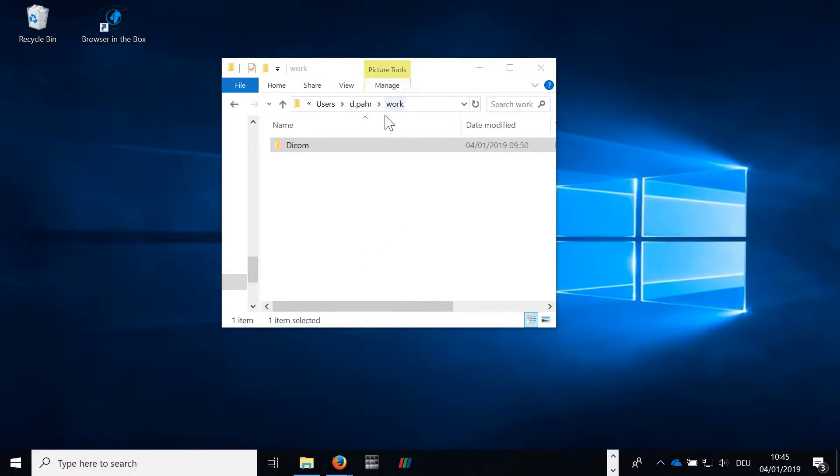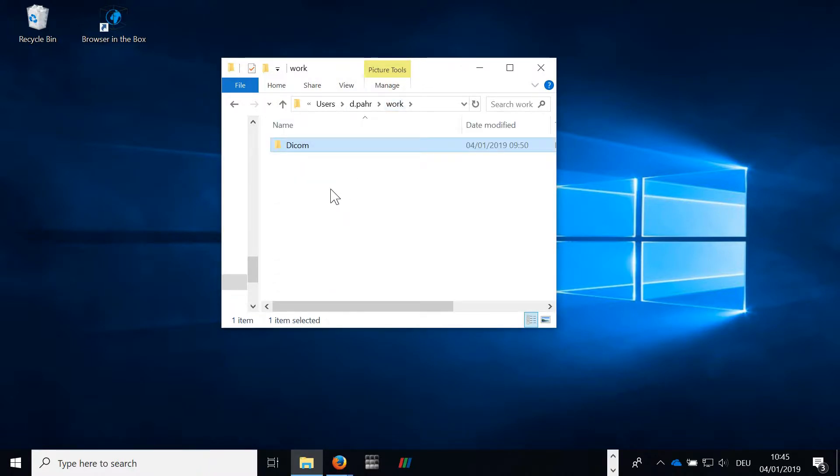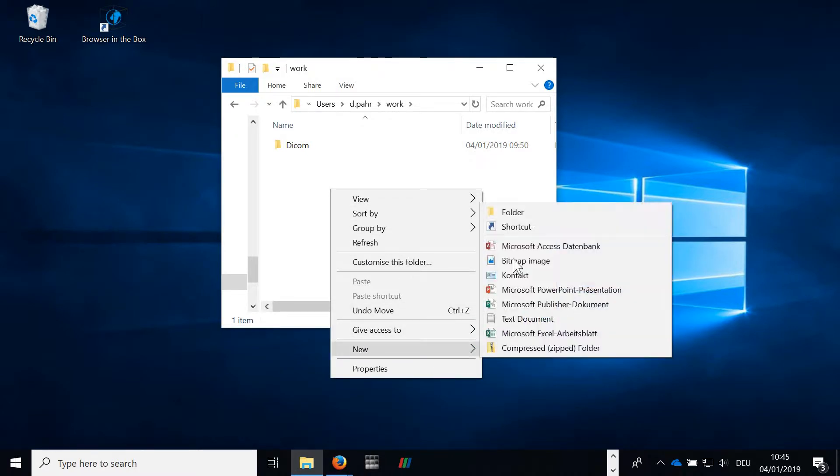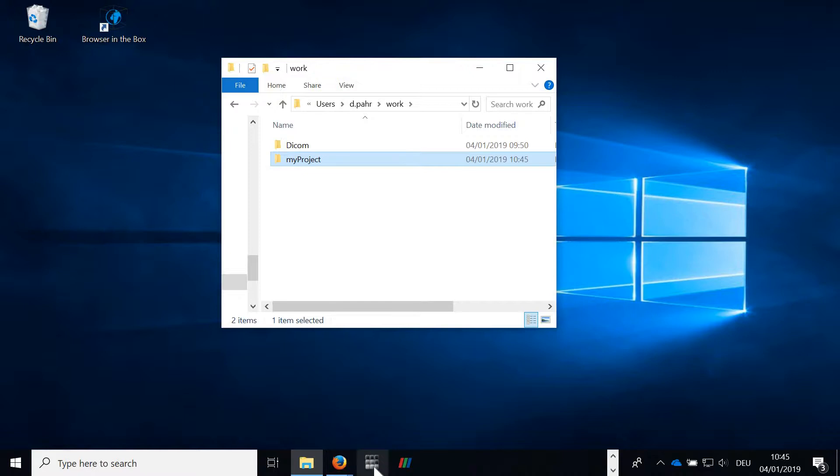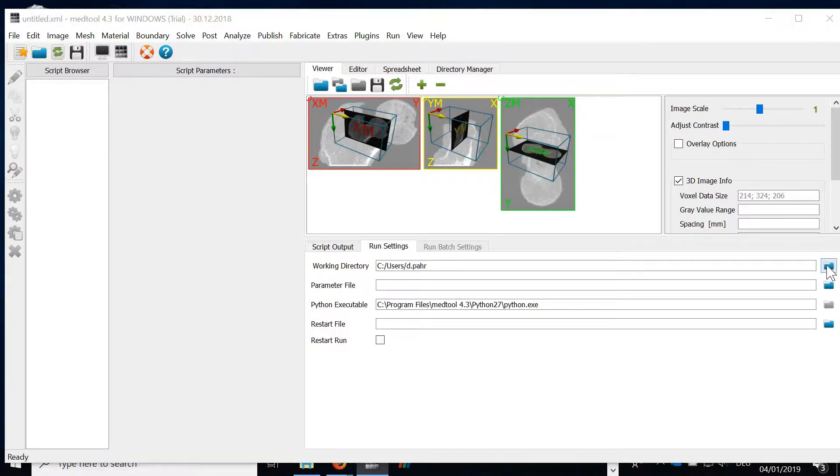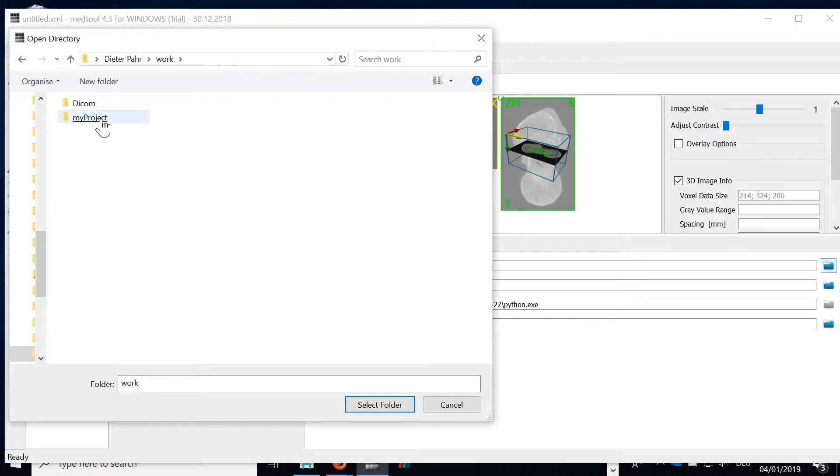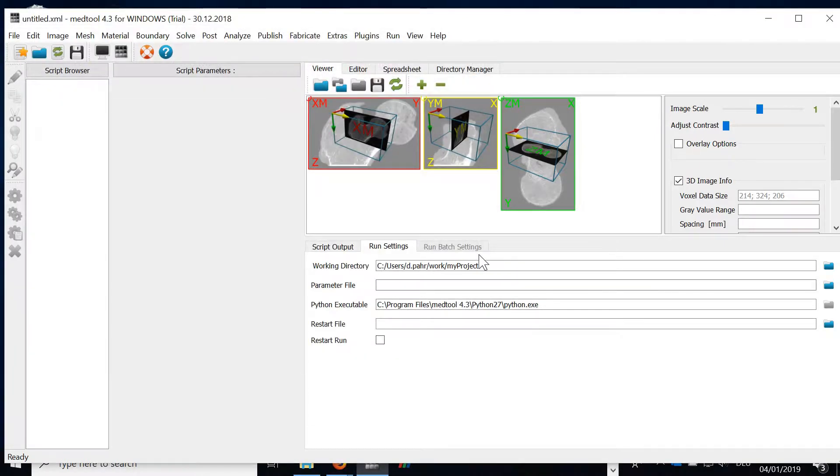I prepared already an example folder with DICOM images in it. First let's create a new project folder which I called my projects. Next we are opening Medtool and we set this project folder as our working directory.